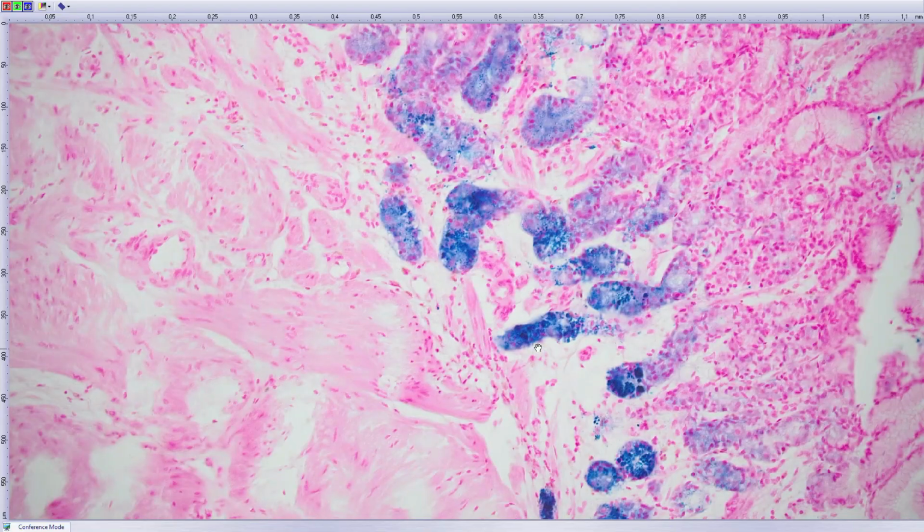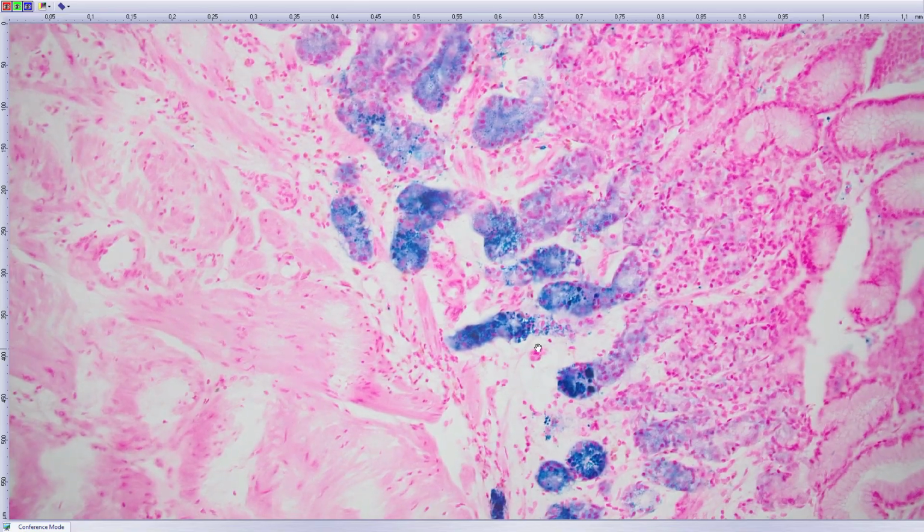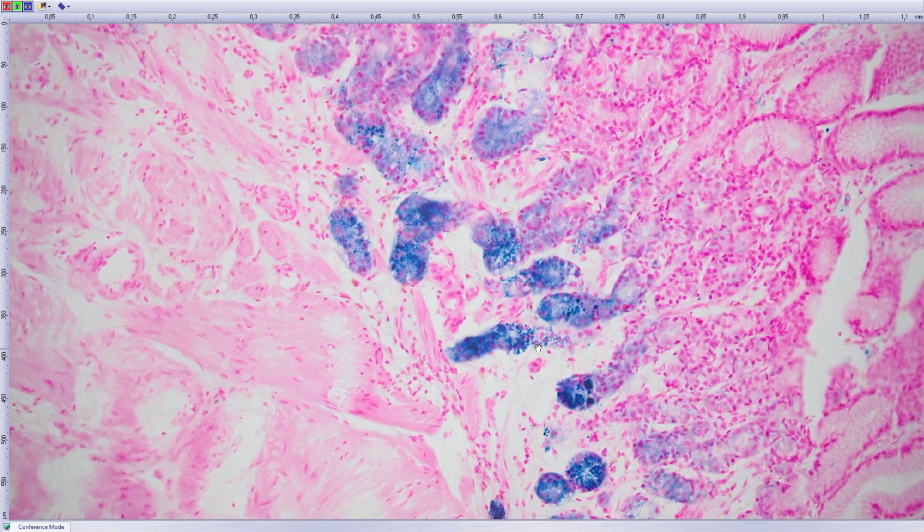So this is quite an interesting finding, because we recognize so-called iron pill gastritis, which is caused by supplements containing iron. But in these cases, the iron particles are present within lamina propria. Sometimes there is some reaction. They may be pictured as so-called reactive gastropathy or chemical gastropathy. But in this case, we have epithelial cells stained.